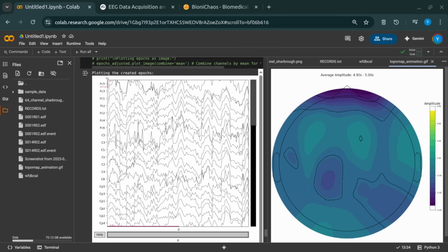Well said. And this deep dive into EEG data visualization really highlights that the human brain isn't just a static collection of regions like you see in some textbook diagrams. Right. It's a constantly shifting, dynamic landscape of electrical activity. What's fascinating here, I think, is thinking about how seeing this dynamism, this digital dance, could open entirely new doors.